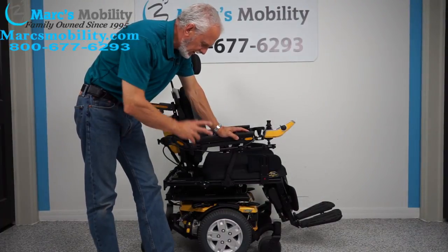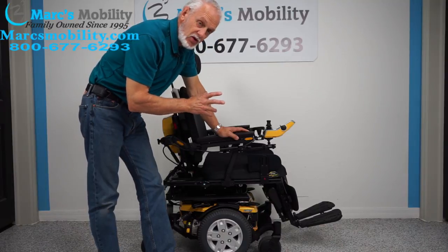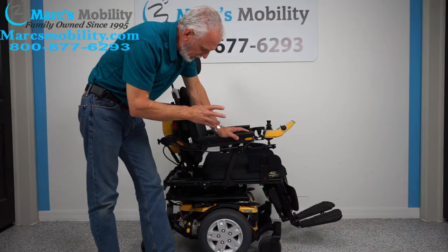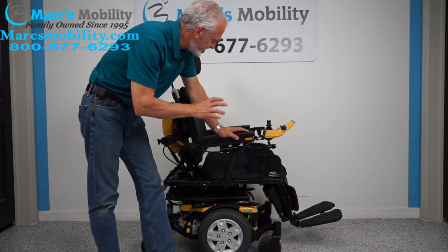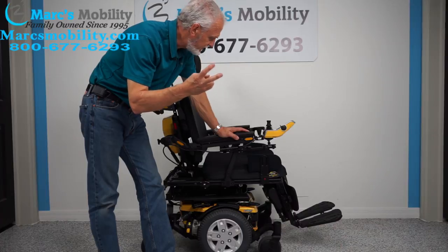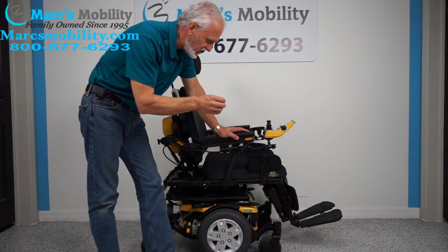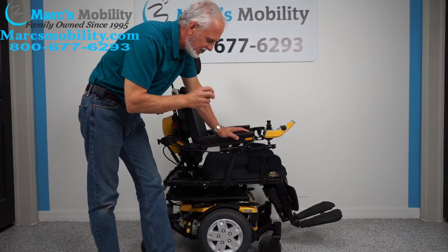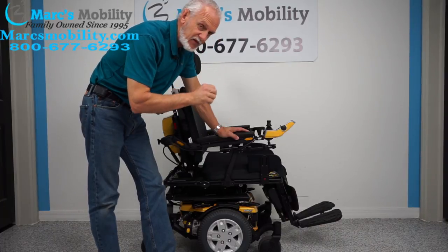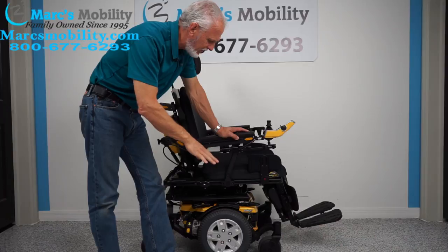Alright folks, we have a beautiful yellow Pride Mobility Quantum Edge HD Power Chair Eye Level. It has the seat lift also. This chair has only 23 miles — it was used maybe for a couple months. If you need an HD chair and you want that seat lift, this chair has a 400 pound weight capability. Because of the seat lift, not 450 but 400 pound weight capability.